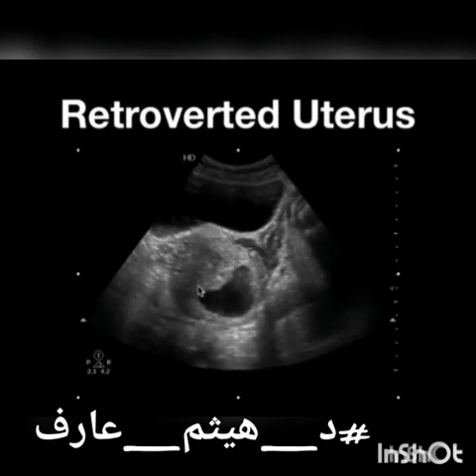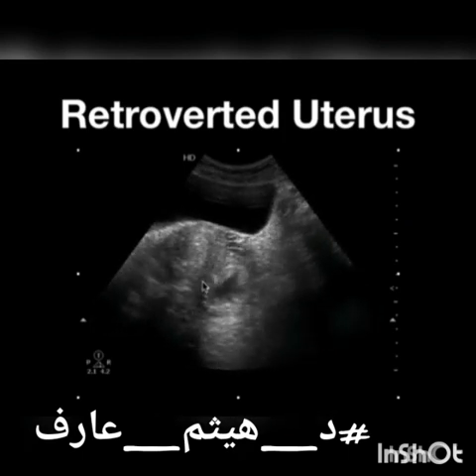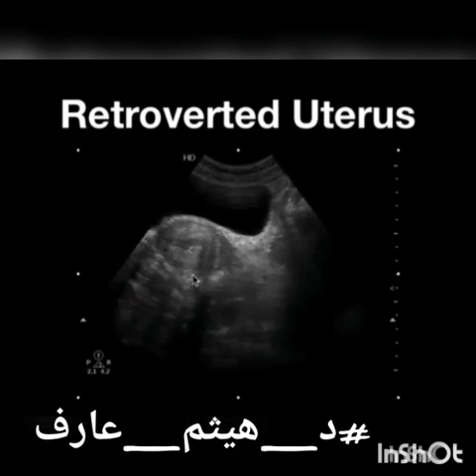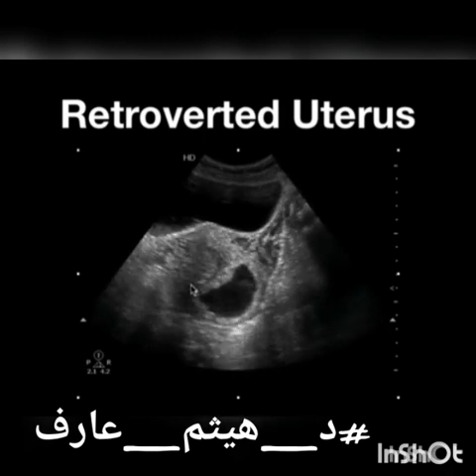Here we have the transverse sweep in the patient with the retroverted uterus. Again, it's going to be the same thing. You're going to angle the transducer so that you're able to fully evaluate from the fundal region all the way down to the cervix. Now let's look at the endovaginal exam.